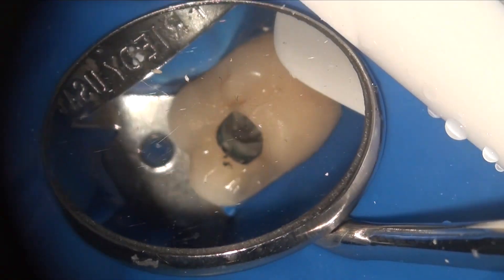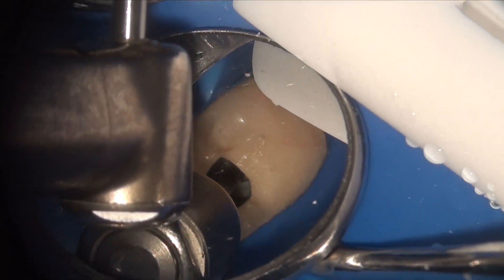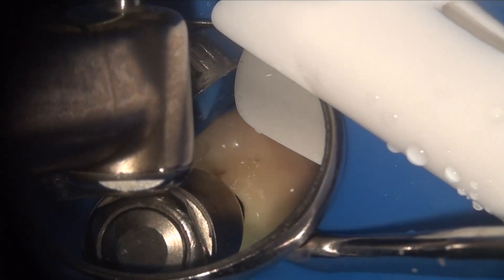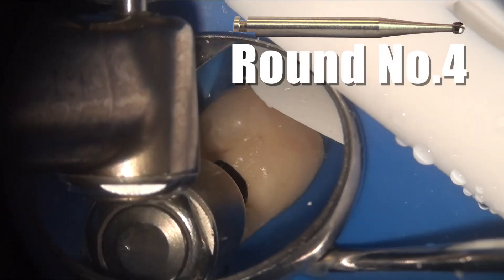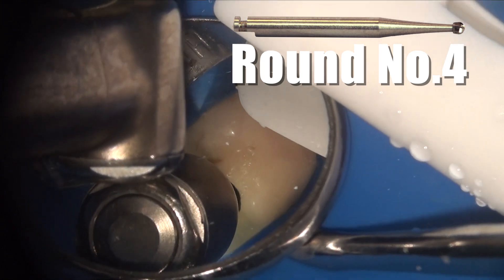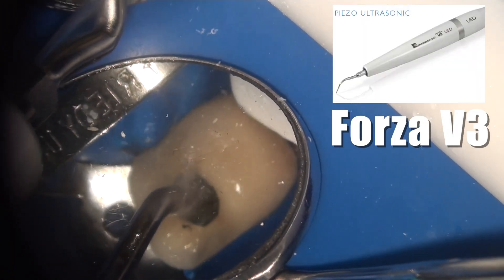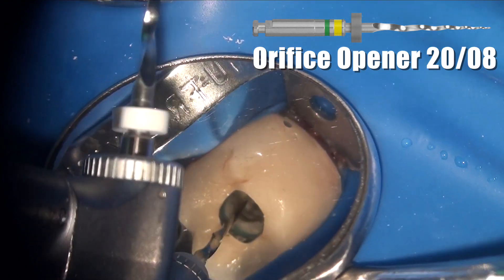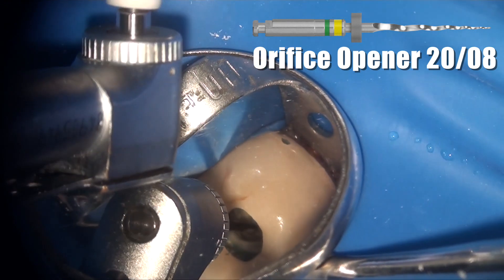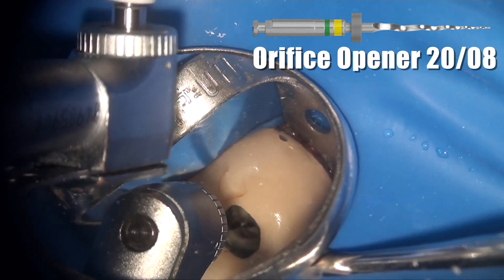This is why the microscope and proper illumination is so important during access preparation and opening into the tooth. The palatal canal was readily present and open for instrumentation. After a little reorientation, the disto-buccal canal was found with the aid of a number 2 and number 4 surgical length round burr on slow speed, followed by the use of ultrasonics. A file was used to determine available length.